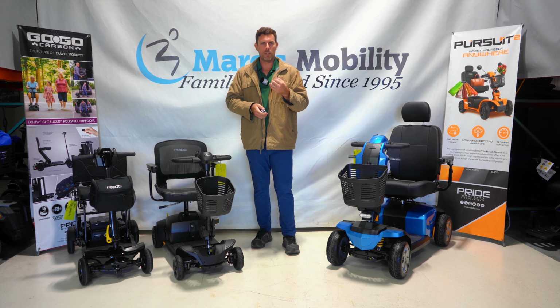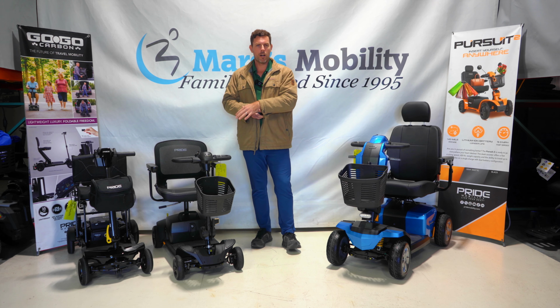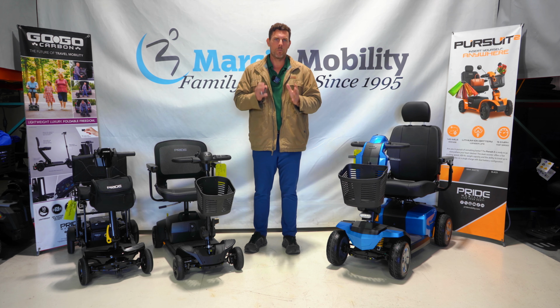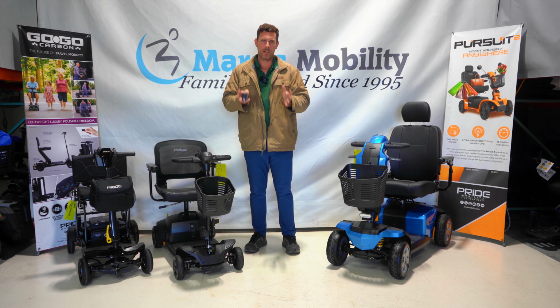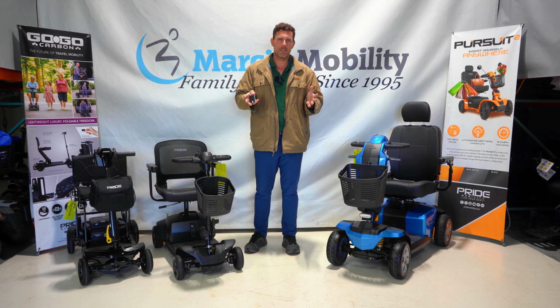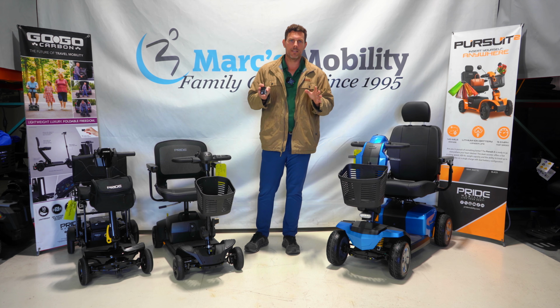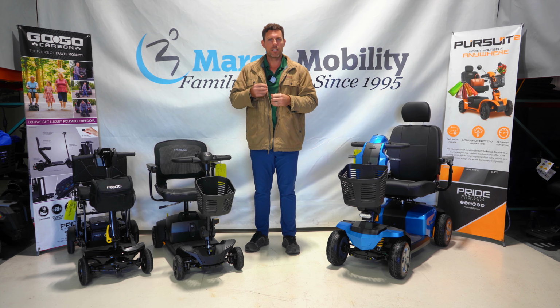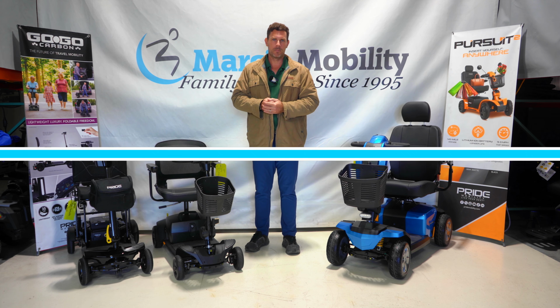So if you give us a call, we can explain to you what that means and what the watt hours is on the batteries. But lithium batteries do have a limitation of what can be on a cruise ship or a plane. Now, if it's a sealed lead acid battery, it does not matter what the size of the battery is. This only pertains particularly to the lithium batteries, which is kind of the new thing on the market that more and more scooters are coming out with.